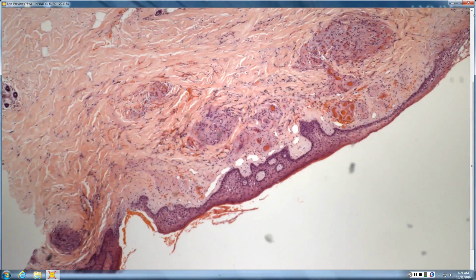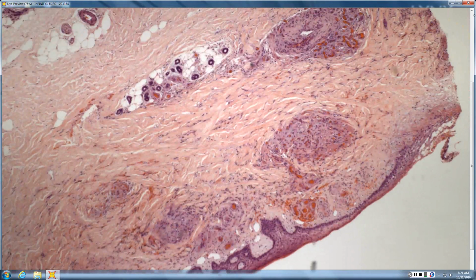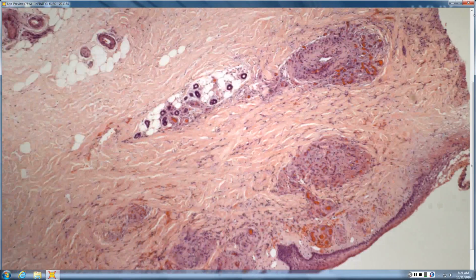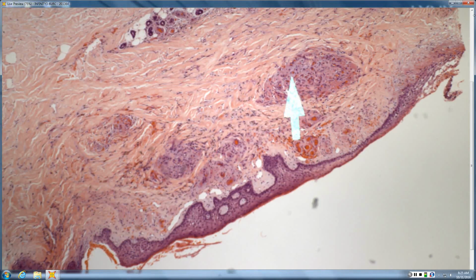Okay, Rob. So it looks like we have some pretty intense fibrin deposition, and a lot of that fibrin is within vessels. So you have lots of fibrin thrombi, and your vessels are in cannonballs. Right. And tell me about the size of the lumen. So this is livedoid vasculopathy. This is livedoid vasculopathy. You've got cannonballs, second time.